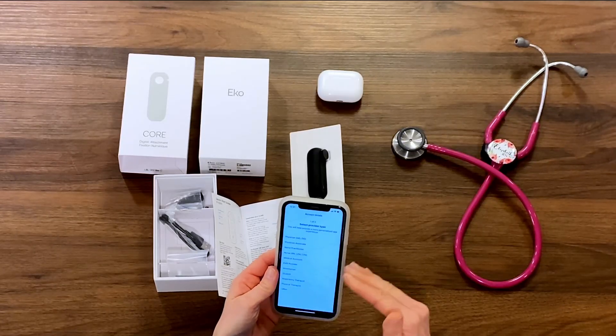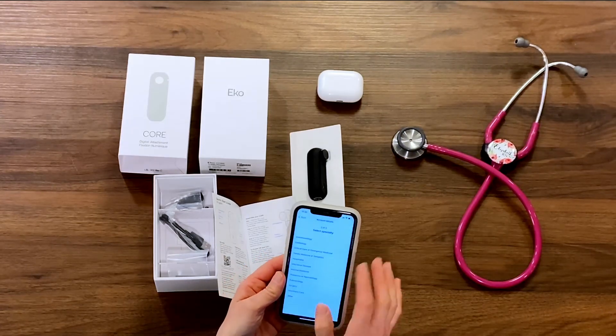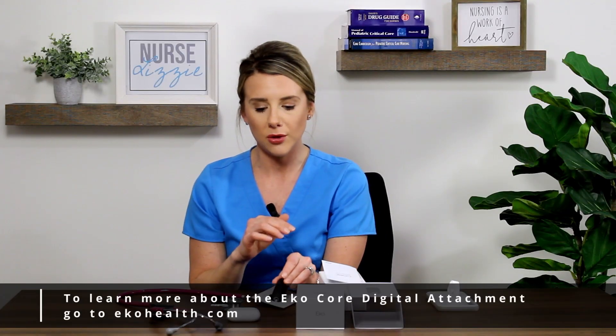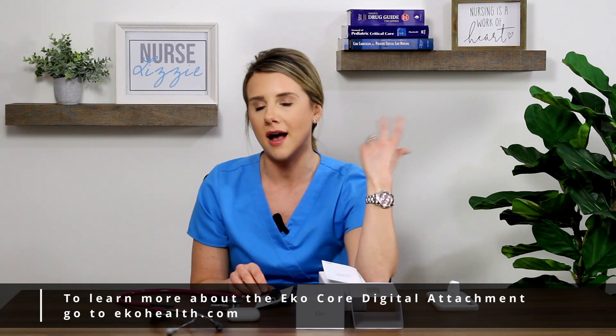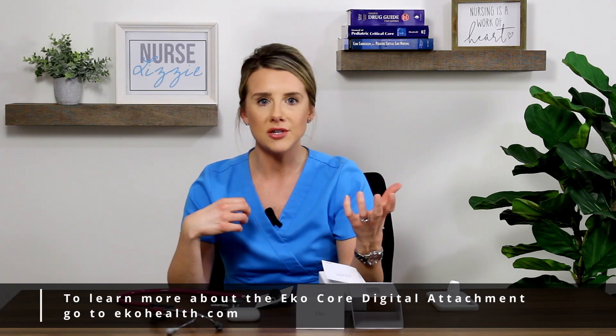I like that you can select the different type of provider that you are — whether you're a student, a physician. I'm going to pick nurse because that's me, hit pediatrics, and hit hospital because that's where I'm at when I'm on the floor with students helping to listen with their patients. I was able to download the app and setup was super easy — just a couple seconds to get everything connected. What's really awesome: it has approximately 480 minutes of battery life, which buys us a lot of time in practice.